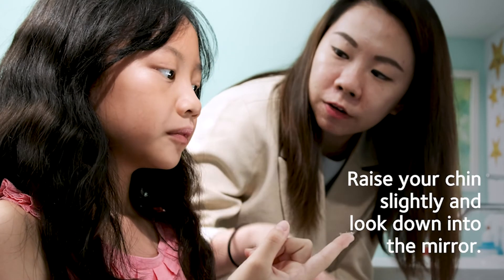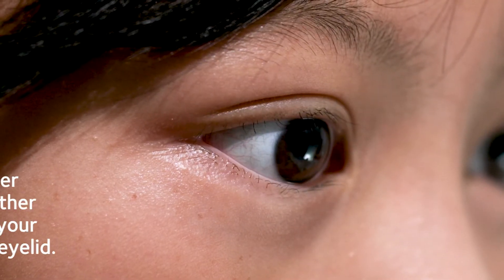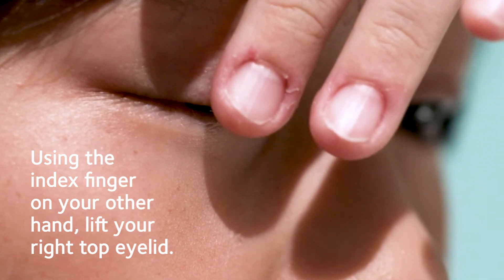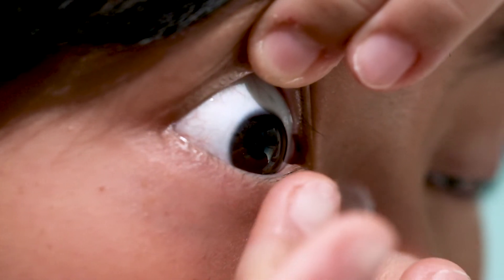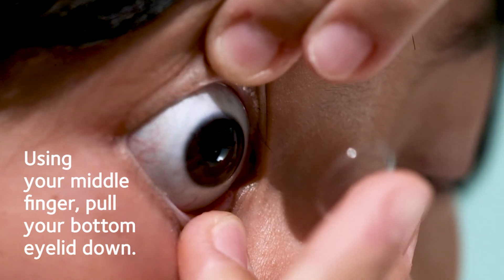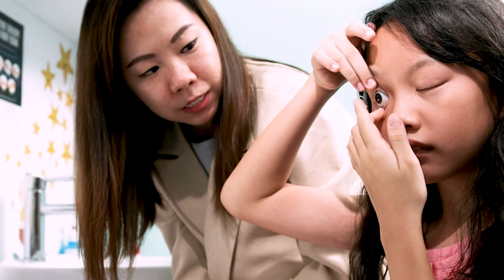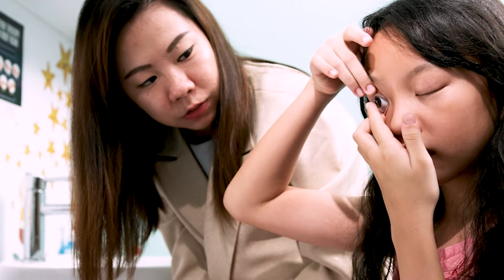Raise your chin slightly so that you're looking down into the mirror. Using the index finger on your free hand, lift your right top eyelid by holding where your lashes meet your eyelid. With the middle finger of the hand holding your lens, pull your bottom eyelid down. To test that you've got a firm hold, try to blink — only your left eyelid should move.